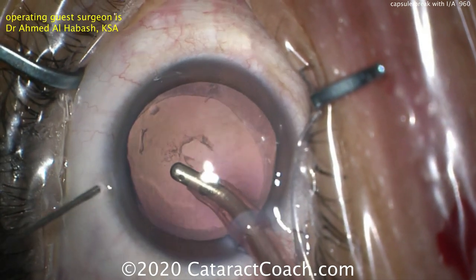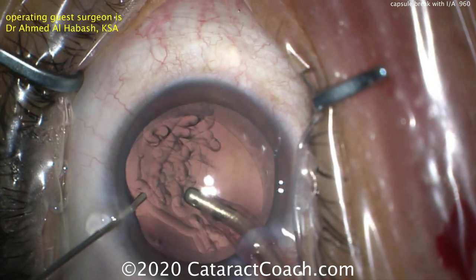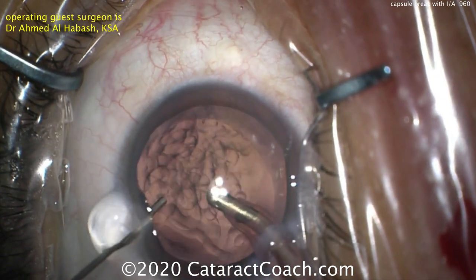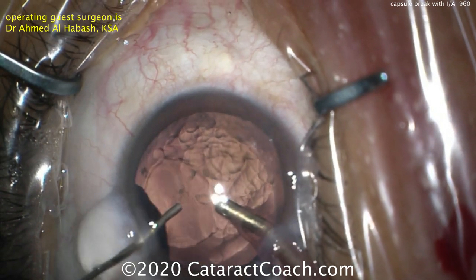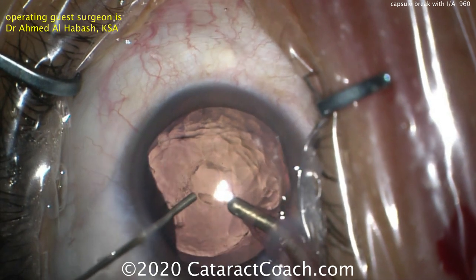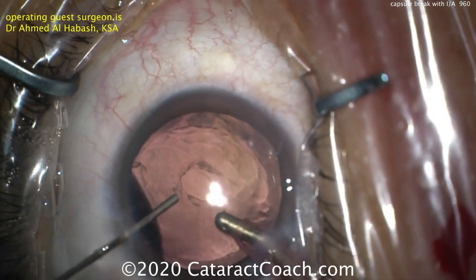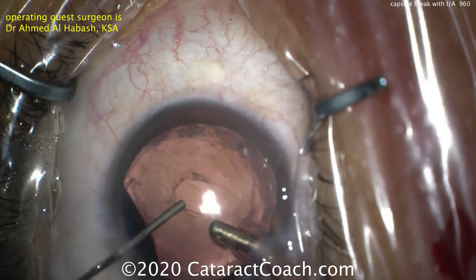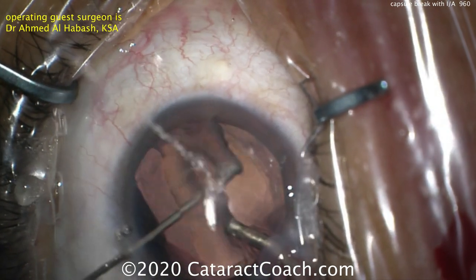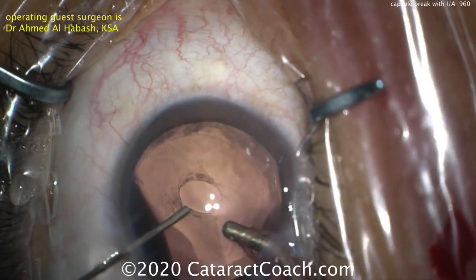With the second hand through the side port incision, viscoelastic can be used to fill up the capsular bag and also to create a barrier. You want to pressurize that anterior chamber again. You can also inject a little through that posterior capsular opening to provide a barrier effect. With the eye that full of viscoelastic, it's a lot more stable with much less likelihood of vitreous prolapse.